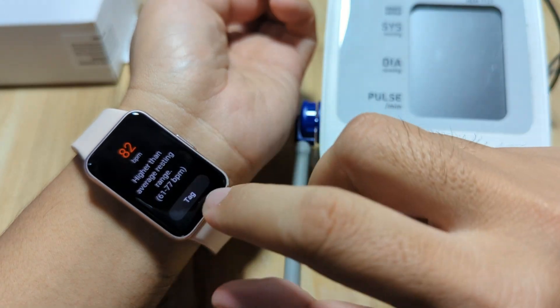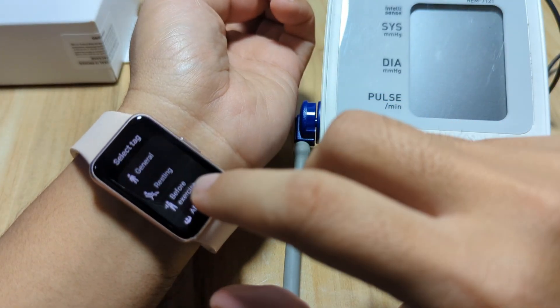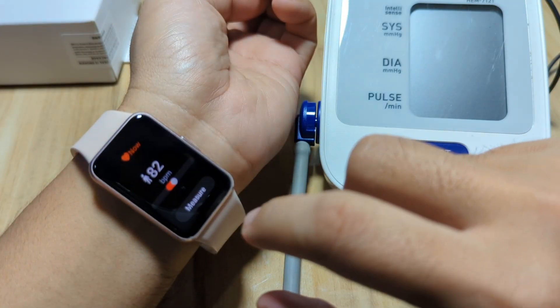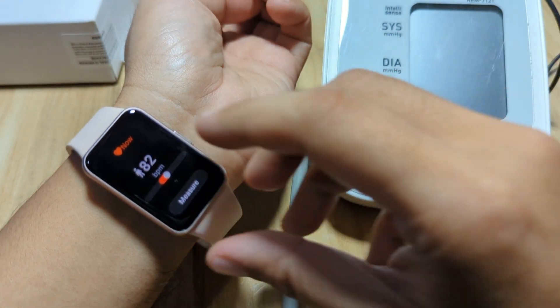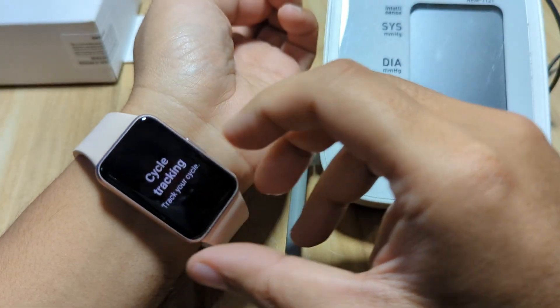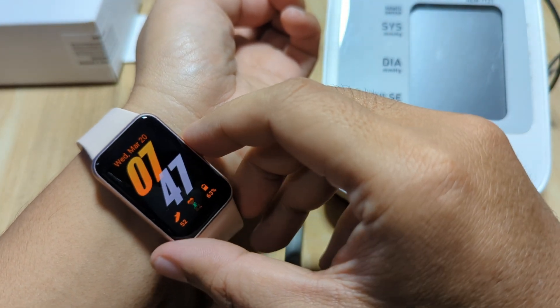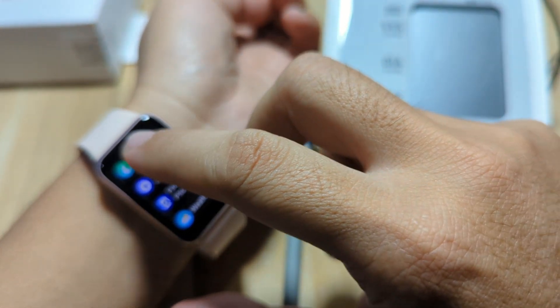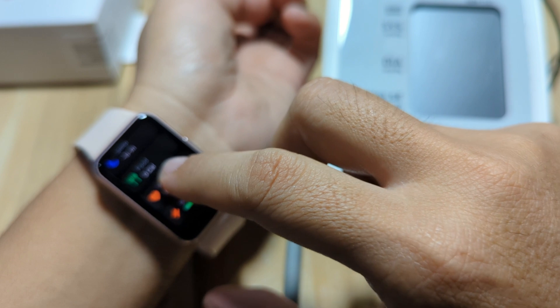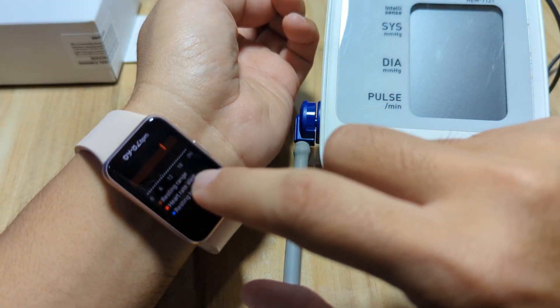So we have 82 beats per minute. We're just resting. Let's select general. So we have here 82 beats per minute for our heart rate. Let's check the health section — we have the heart rate graph here showing 82 beats per minute.